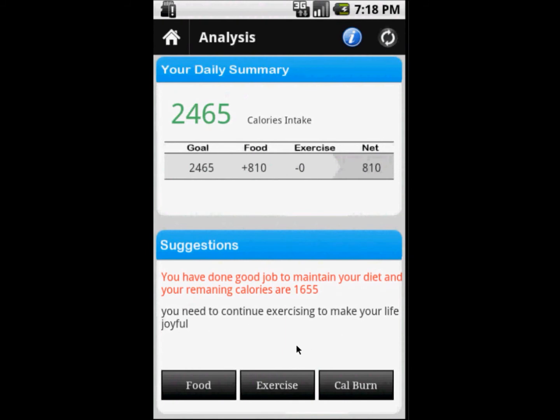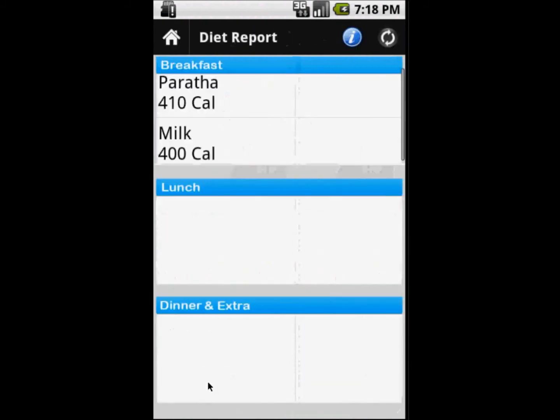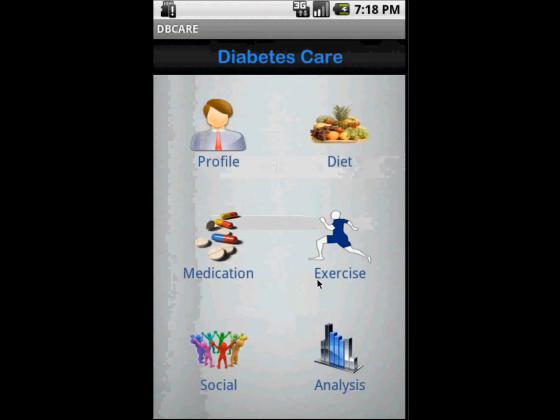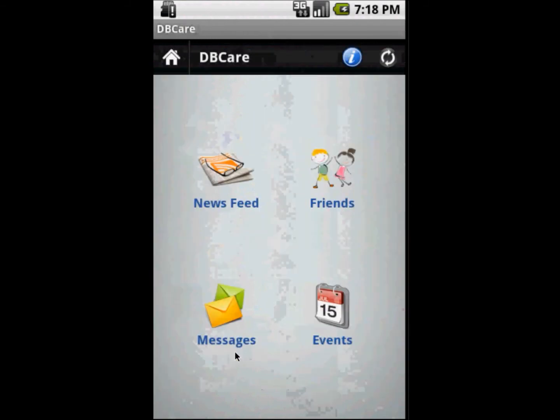After entering that information it gets saved to the database. We can also see the analysis part — here are system-generated suggestions for what you should do based on your seven-day data. You can also see what you have eaten daily and the application also shows your daily goals.